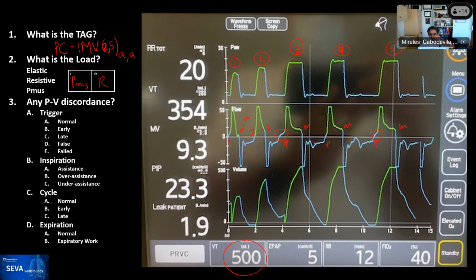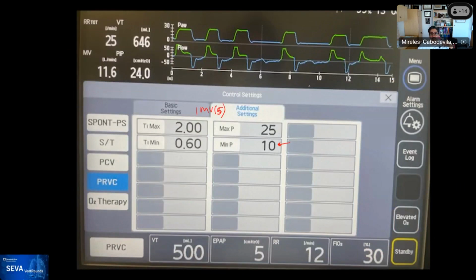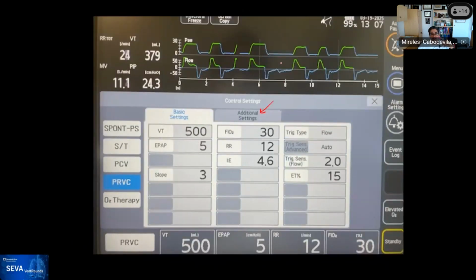And then I will highlight, you see this little hump over here as well as this hump over here after an exponential decay. You see the exponential decay, and then the hump. This makes me concerned for a failed trigger on these patients, and so there's late and there's failed, and it becomes more evident right here with this one and this one over here, and even more evident on this over here. So there's another one here, and another one here.